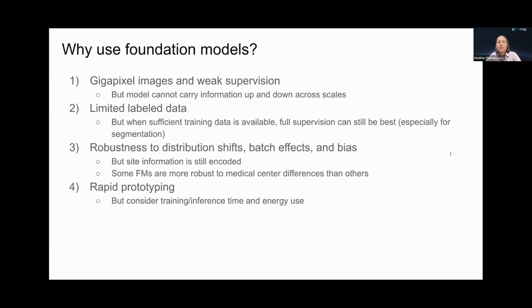But keep in mind, this type of model doesn't carry information up and down across the scale, so it can't replicate the way a pathologist might analyze whole slides. The second reason was if you have a limited amount of labeled data, and also a great reason for using a foundation model. But keep in mind, when you have sufficient training data, full supervision sometimes is the top performer, and I've seen this more for segmentation than for other tasks.